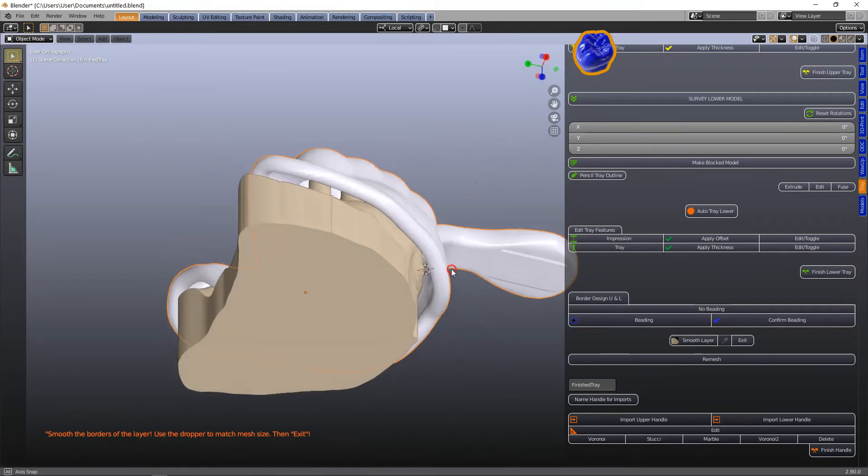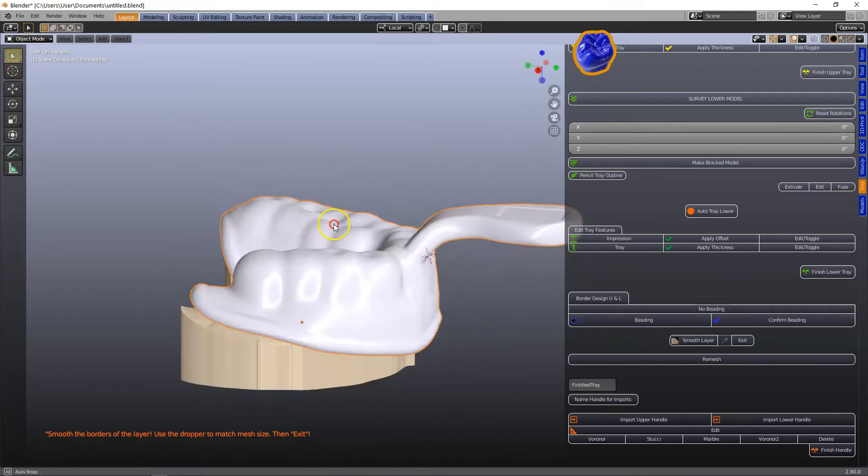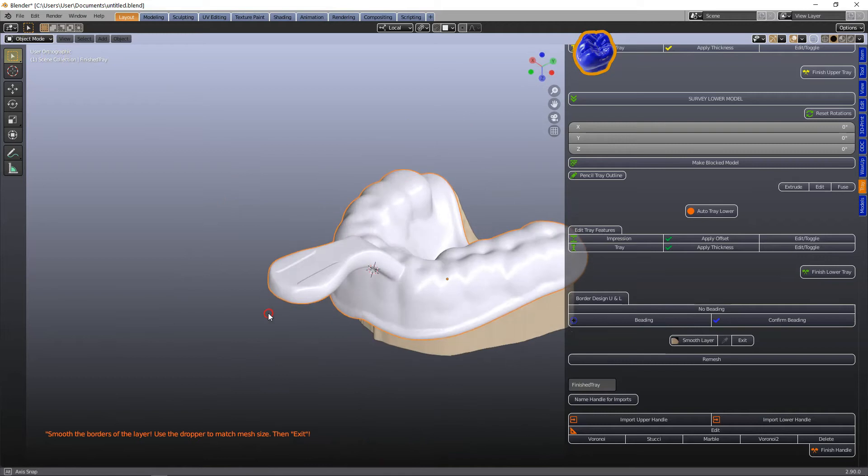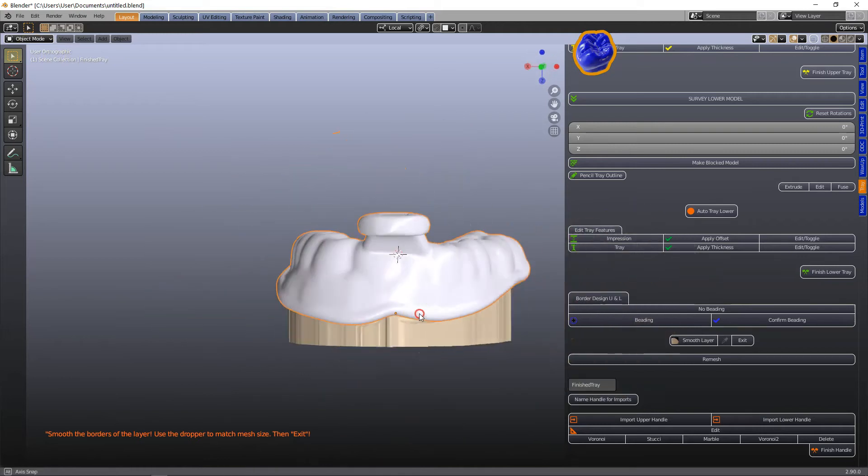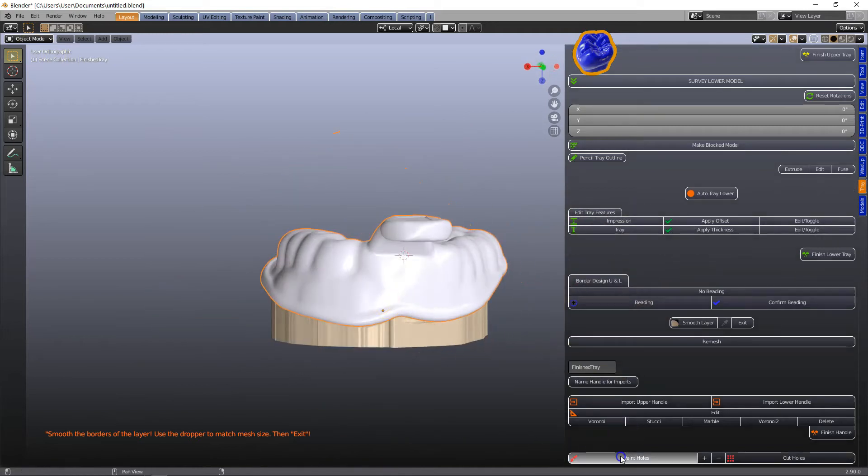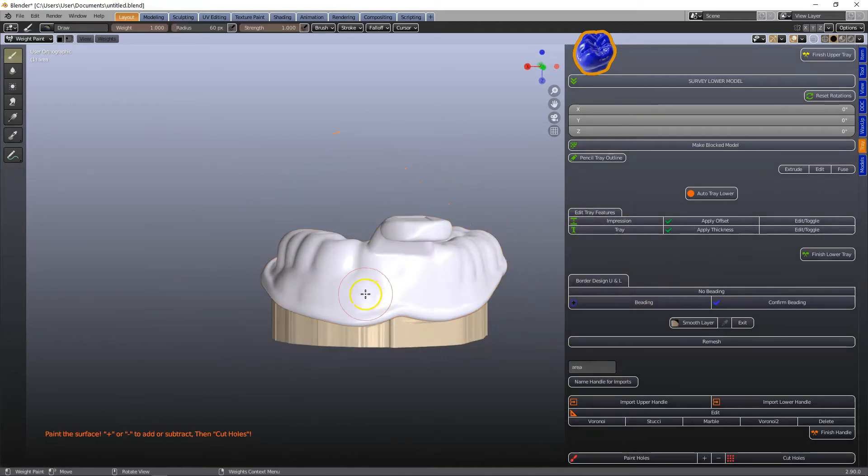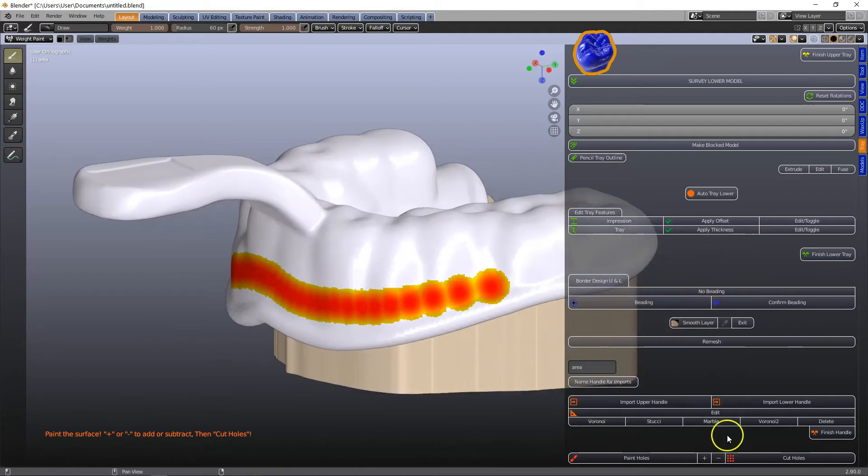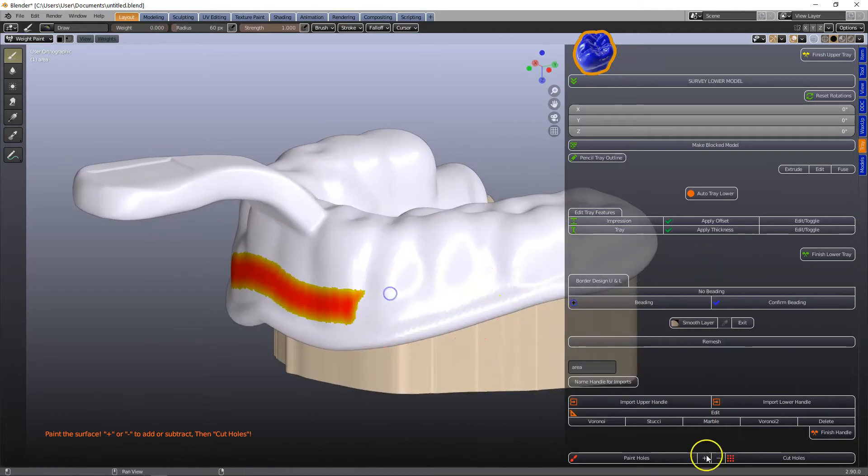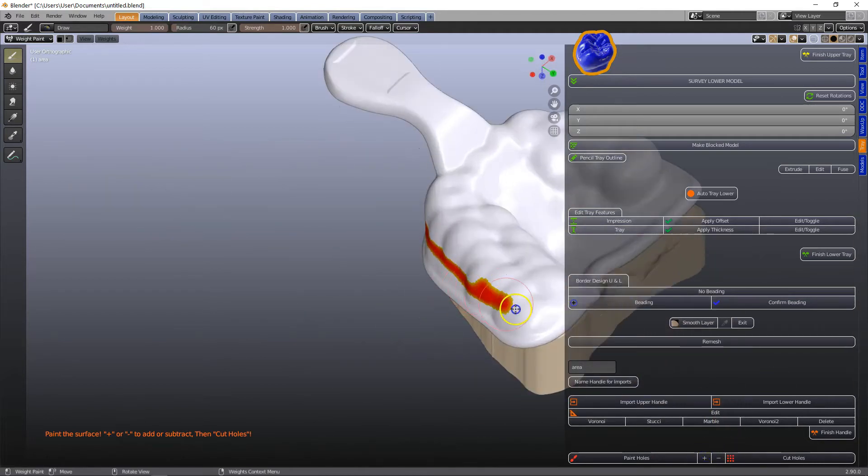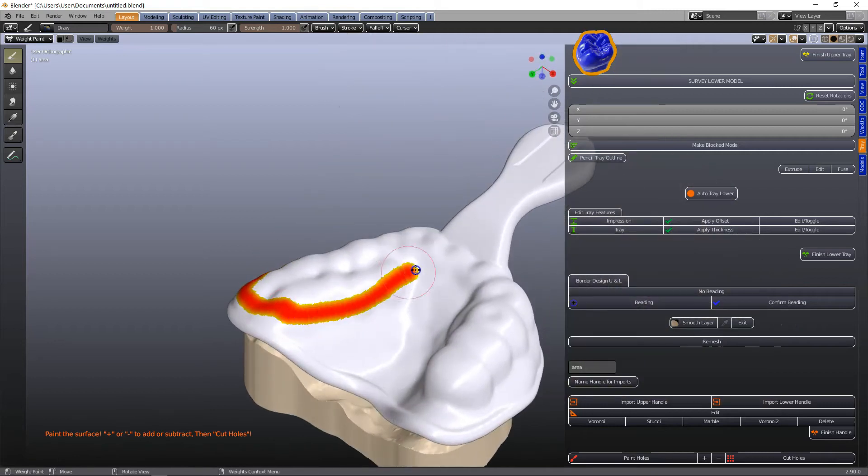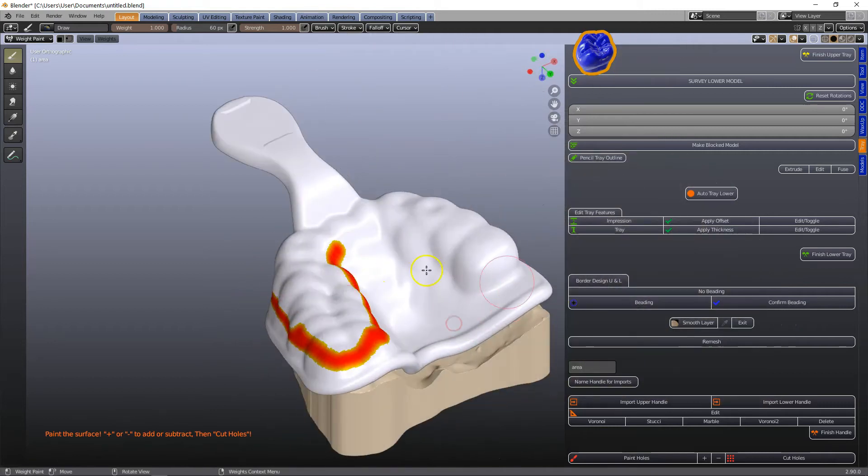After that I'm going to decide to paint a few holes in the tray. Click on paint holes. If you do make a mistake click the minus and that will get rid of your selection and wherever you paint the red side we will be able to make some holes in it.